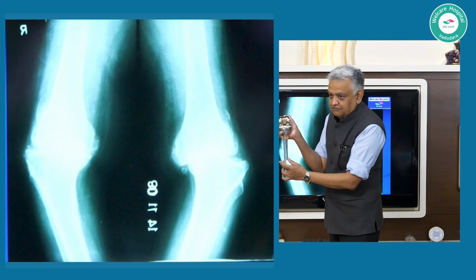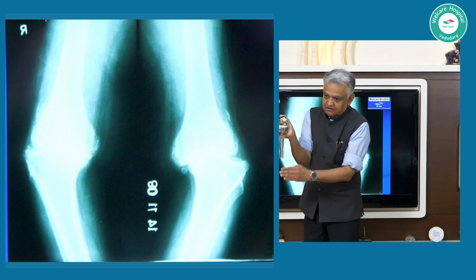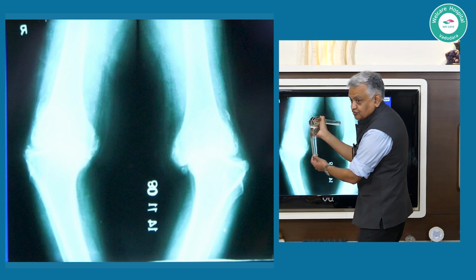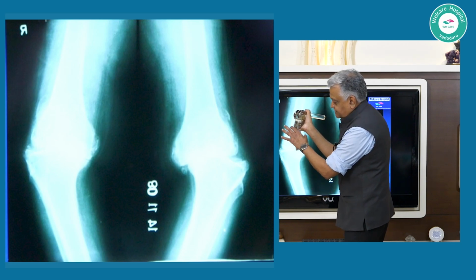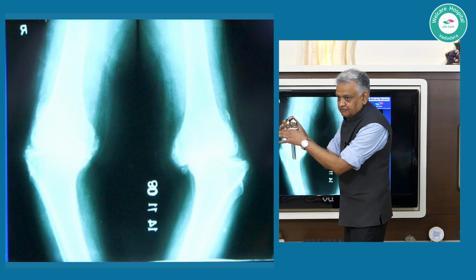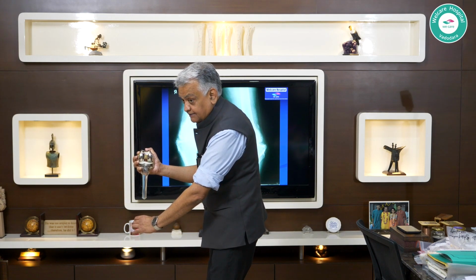So when you have your tibia straight, like this is the foot, so you have it straight aligned like this, vertical to the horizontality of the ground. Then also from the lateral side you ensure that it is straight. From the medial, AP side also, it should not be like this. It should not be like that. Once you have arranged your tibia vertically, like so, now you have clasped your proximal tibial cutting block here, clasped the ankle with those clamps.